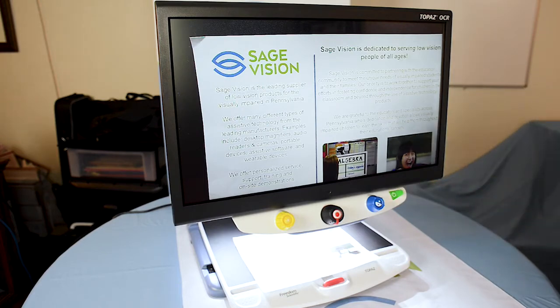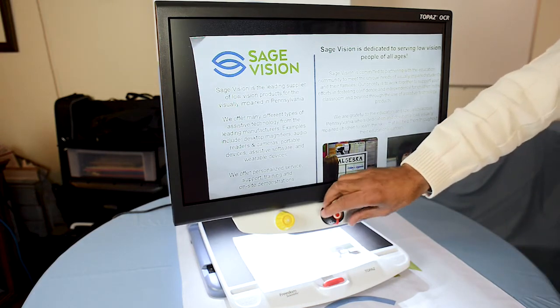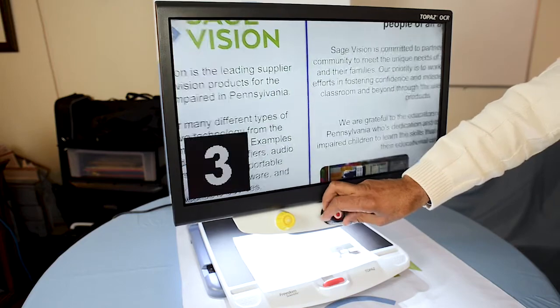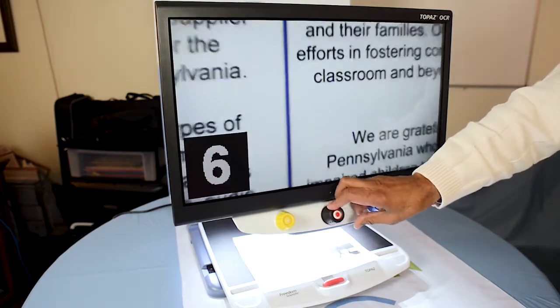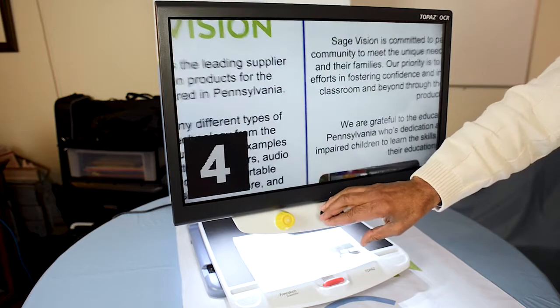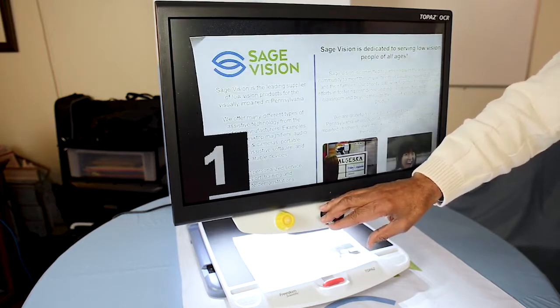To start off, the magnification is the middle black knob here. You can turn the knob to the right or clockwise to increase magnification, or turn it to the left or counterclockwise to decrease magnification.